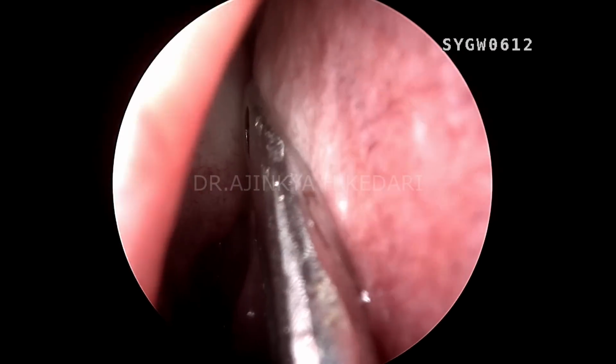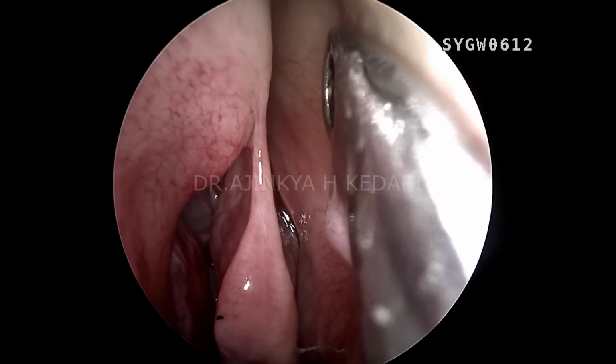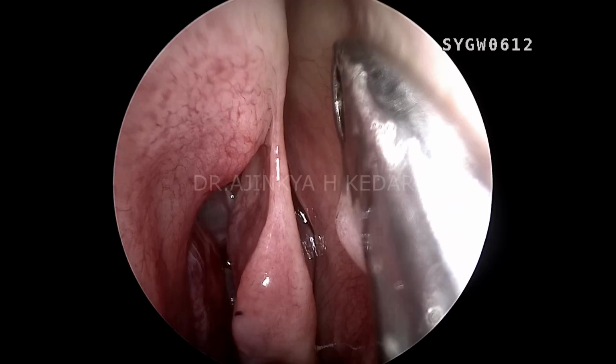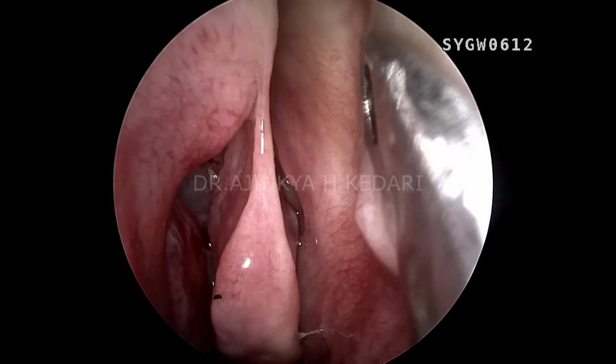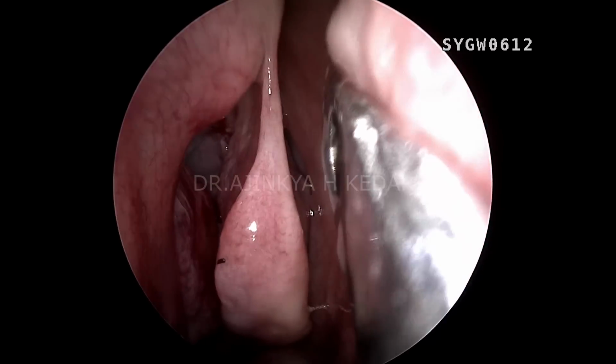See, that's a high level DNS up there. It's blocking the area superior. You can see when I retract the septum midline, there's a lot of space that it was blocking right away. So that's the space medial to the middle turbinate.